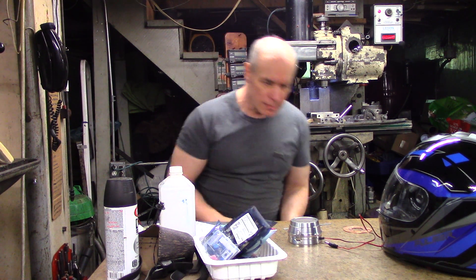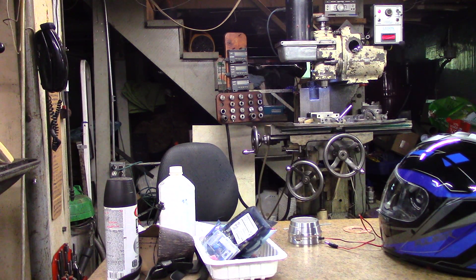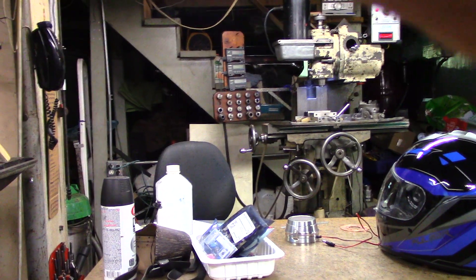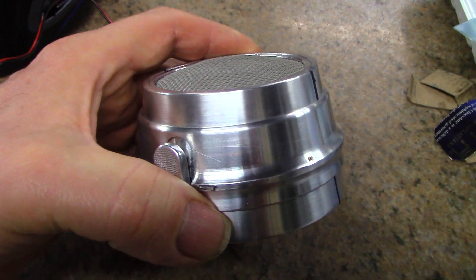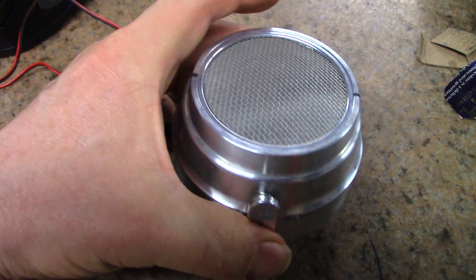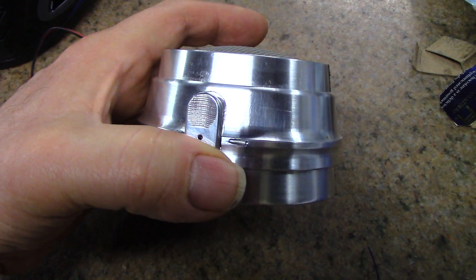Hi, my name is Joe753. Welcome to the Ultraviolet Pathogen Killer Respirator Project. Show you what I've got here so far. What I've been making for the last few months is a unit that kills pathogens with ultraviolet light and contains the light to keep it from giving you skin cancer or wrecking your retinas.